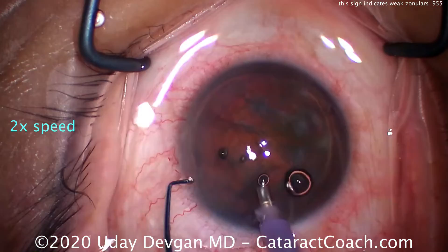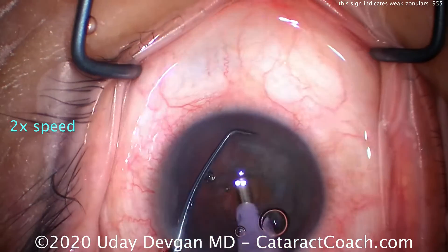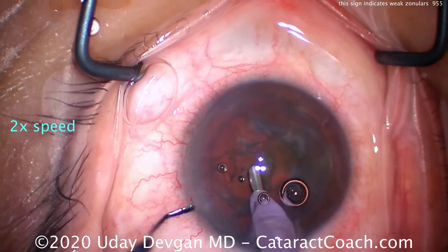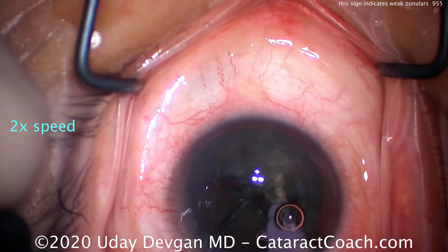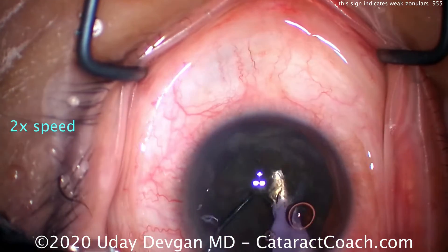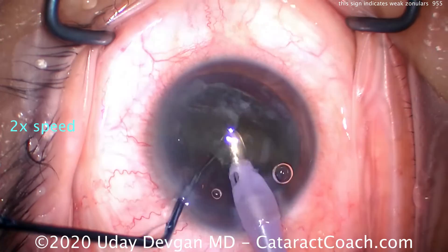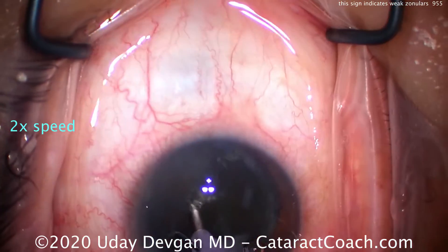We're going to do a variation of chop here, and the key is to not put pressure on the capsular bag. First let's lift up that iris and fix that reverse pupillary block. The phaco probe goes in, there's the chopper, and we get two halves. I'm going to bring the first half out of the capsular bag completely and emulsify it at the iris plane, so we're not putting any pressure on the capsular bag itself.